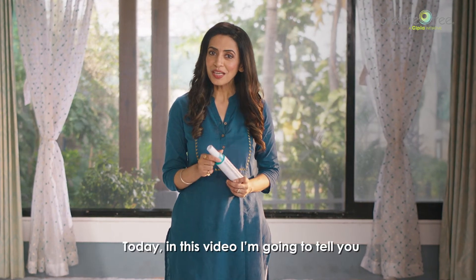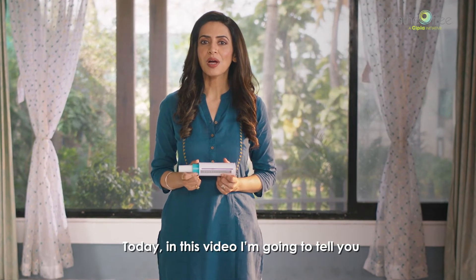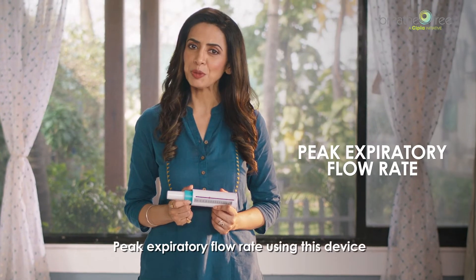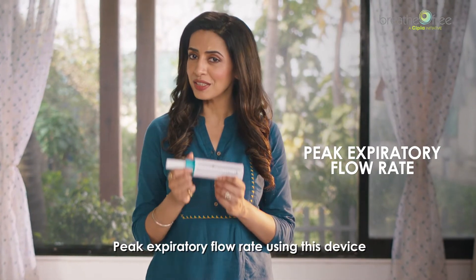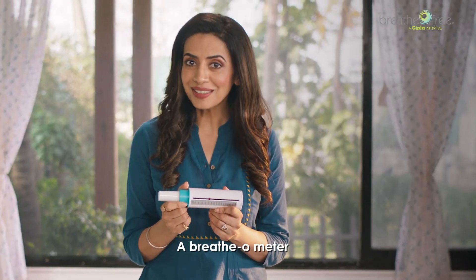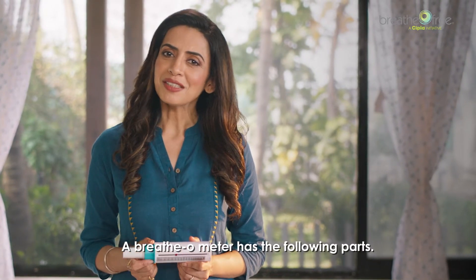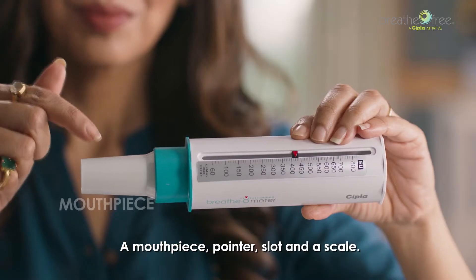Hello everyone. Today in this video I'm going to tell you how to correctly measure your lung function, that is PEFR — peak expiratory flow rate — using this device, the breathometer. Let's get started.